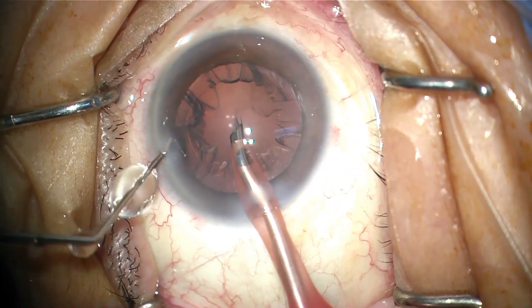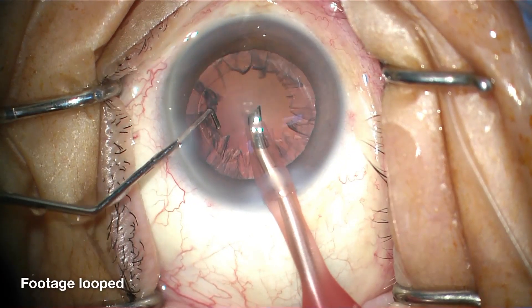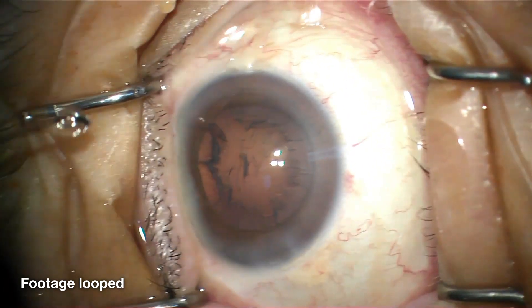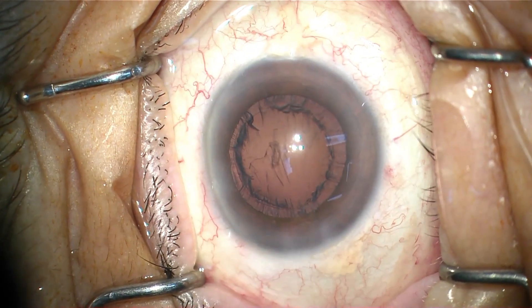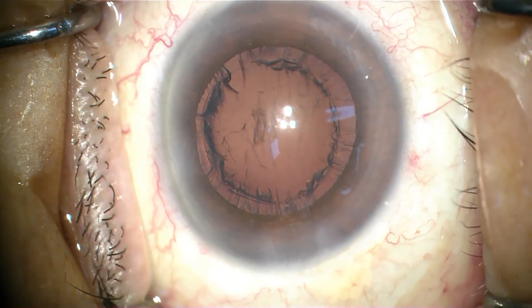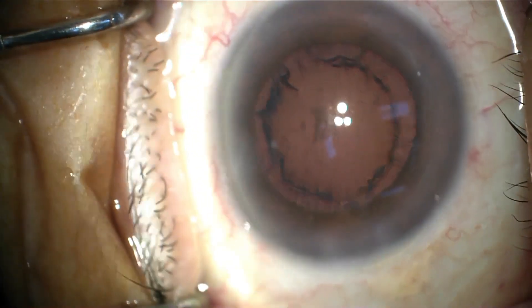In phacoemulsification, intraoperative incision leakage can occur, especially after the withdrawal of a handpiece tip. Without the support of irrigation, usually with an ophthalmic viscoelastic device (OVD), intraoperative leakage could lead to the transient collapse of the anterior chamber — changes which can be subtle when viewing through the surgical microscope and potentially neglected.